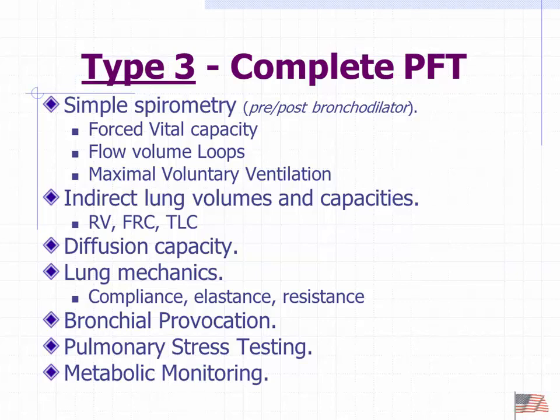And similar to the pulmonary stress test, as far as measuring oxygen consumption and CO2 production, we can do this in a resting state, with the patient lying in bed, and determine how much energy they burn on a daily basis. Why would I care about that? Well, we're going to find that with COPD patients specifically, diet makes a huge difference. What they eat is going to affect how they breathe. And if they're on a mechanical ventilator, what they eat is going to impact how easy or hard it is to get them off the ventilator.